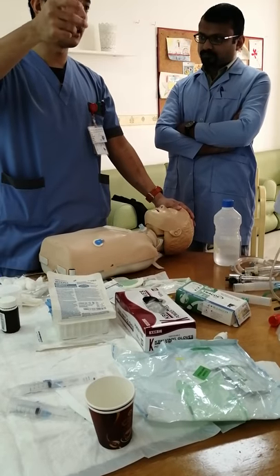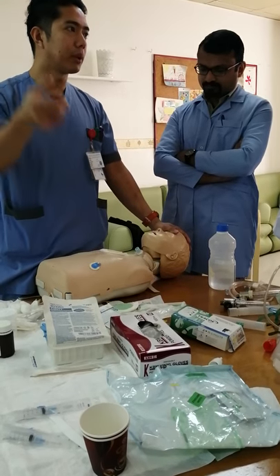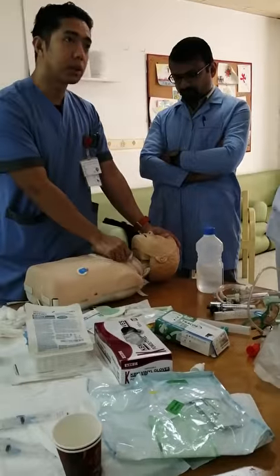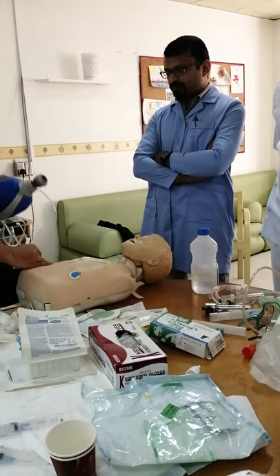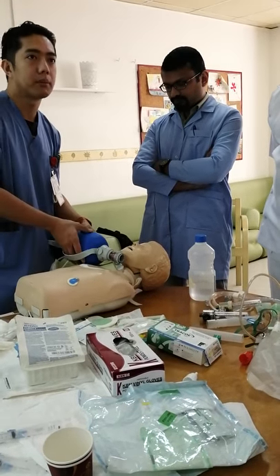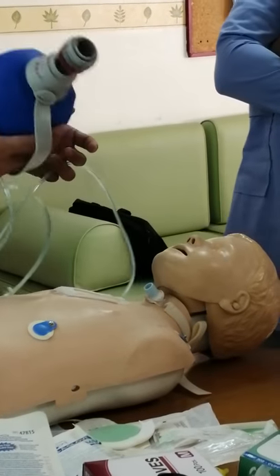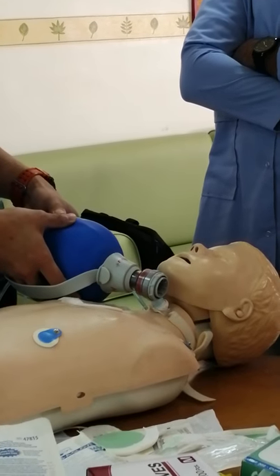Now you're ready. Before the tracheostomy care, do two things: hyperventilate the patient and check the lung sounds. Check the lungs first so you can compare afterwards if there's improvement. Grab your stethoscope, listen to the lung sounds — you may hear crackles or secretions. Then hyperventilate the patient. If connected to oxygen, put it on full blast and wait one minute before doing care or suctioning. After one minute, return to normal flow and start tracheostomy care. For ambu bag hyperventilation, give breaths for at least 30 seconds.